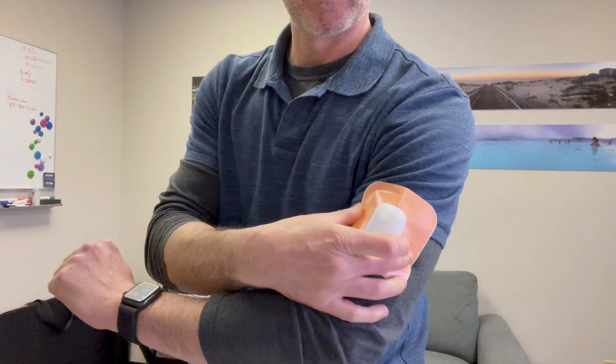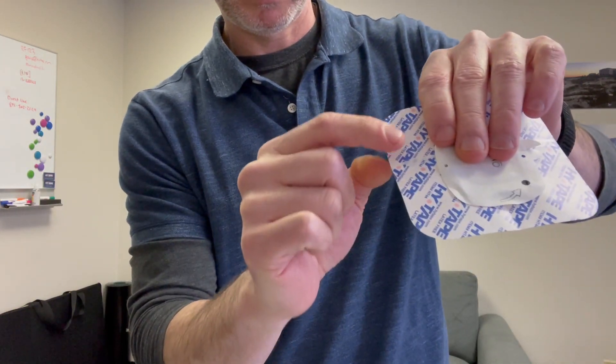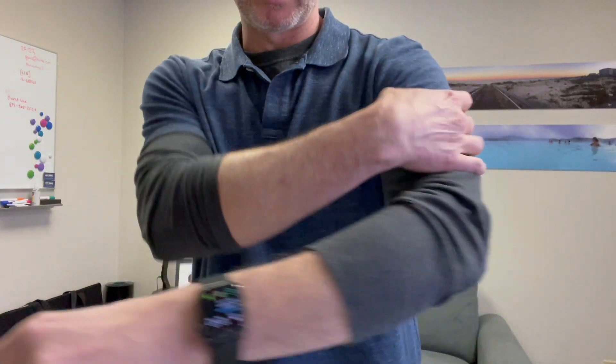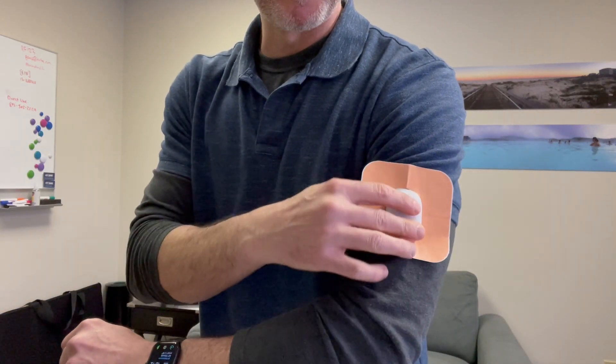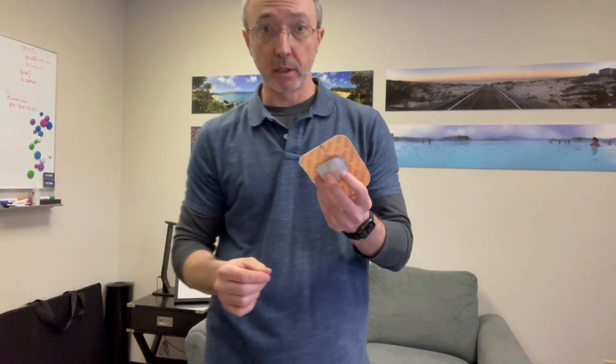If there's too much tape around it, you can try to trim it a little smaller so it's not such a big piece — especially if it's a child, you don't want it to wrap around the entire arm. This can be done for any type of delivery system or monitor.